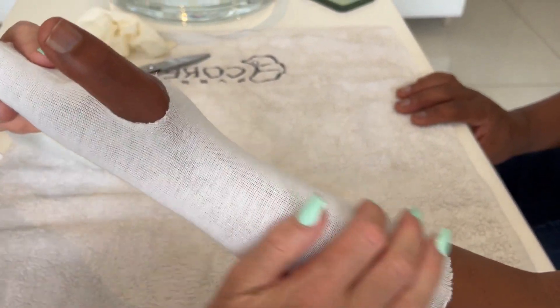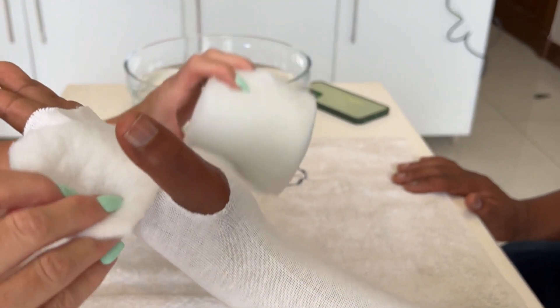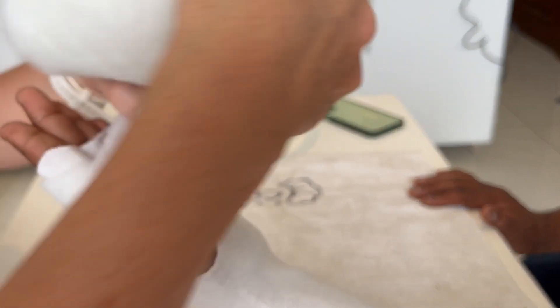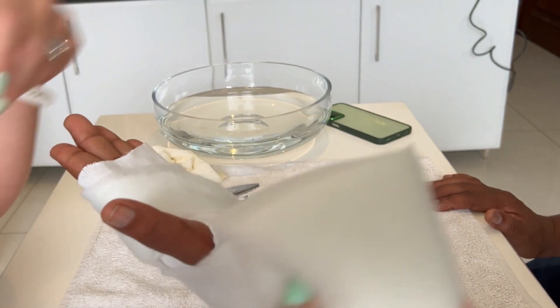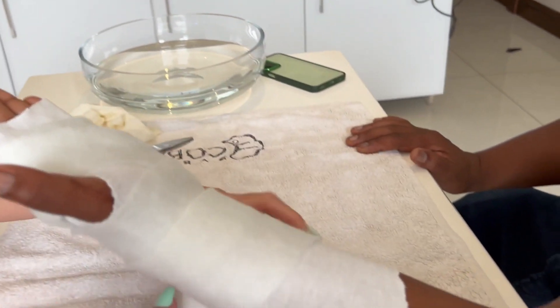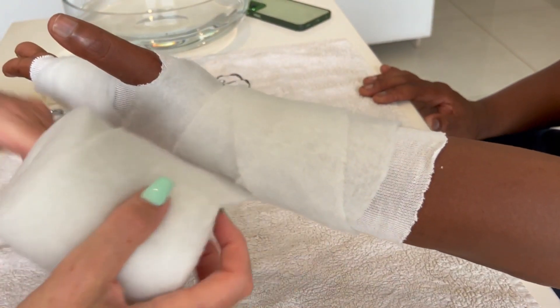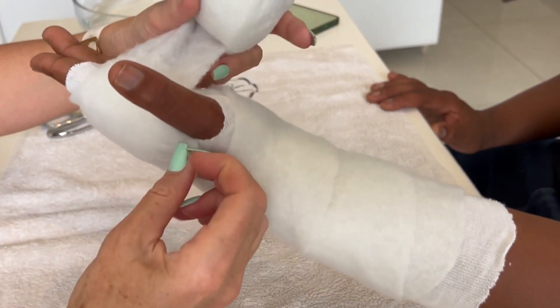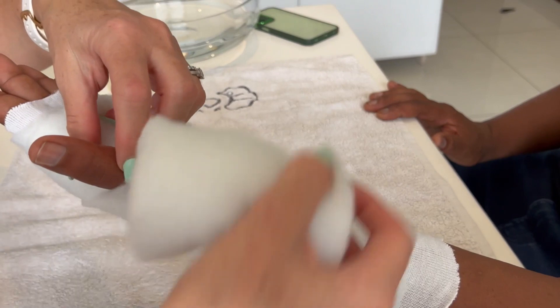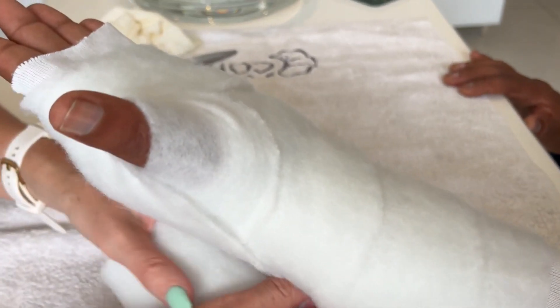I've popped the stocking net on, and we're going to be immobilizing the MP joints. I'm going to wrap two layers of cotton padding. This cast is going to be for three weeks, and then hopefully we can make it removable. But with this heat, you might need a new one. After three weeks you need to come back — we remove it, and we either make a new one or make it into a removable cast.